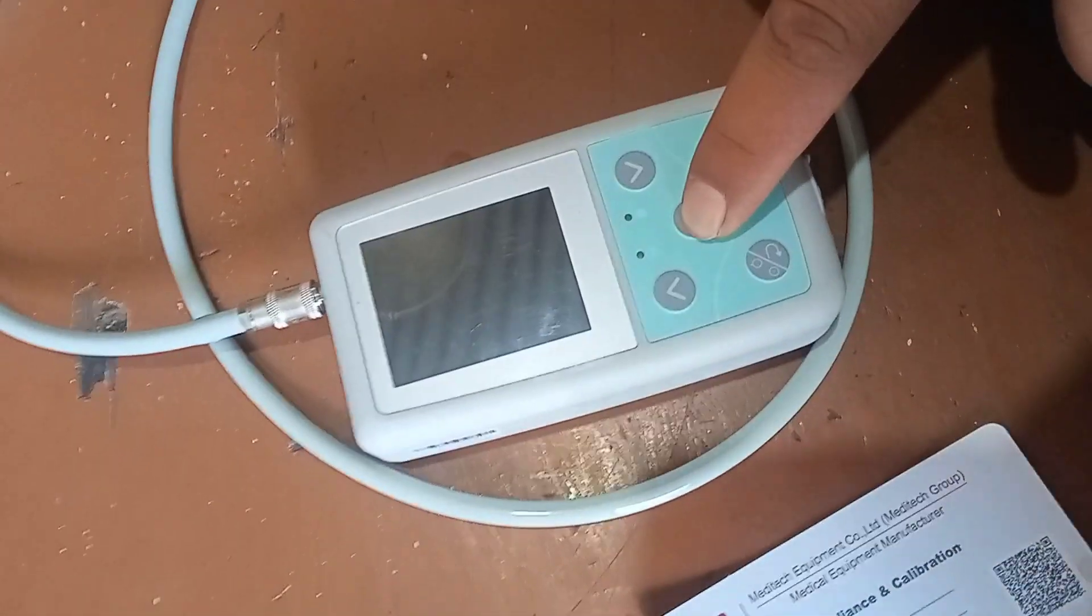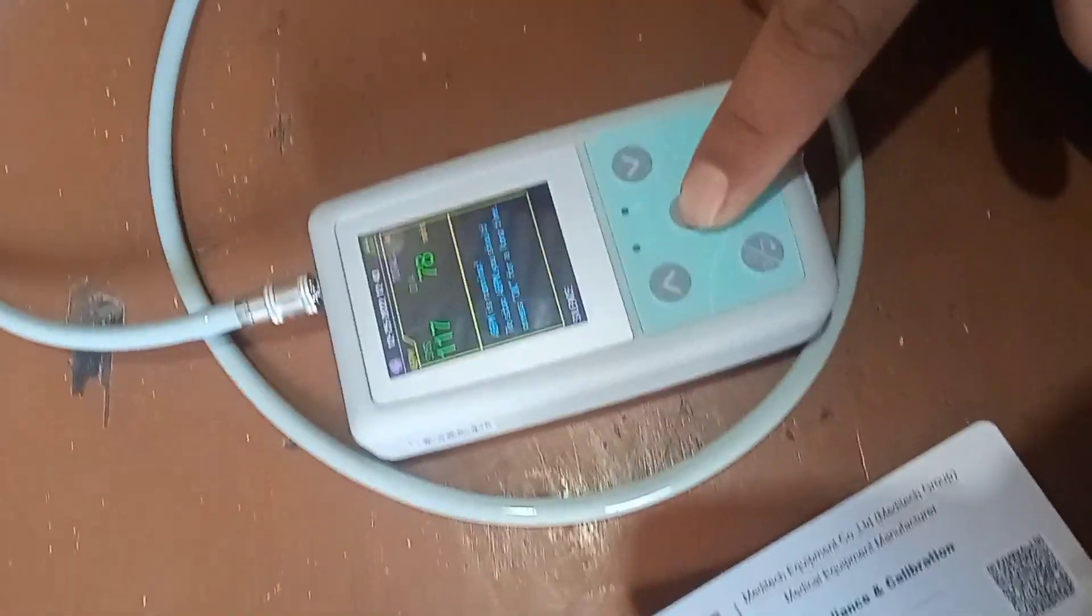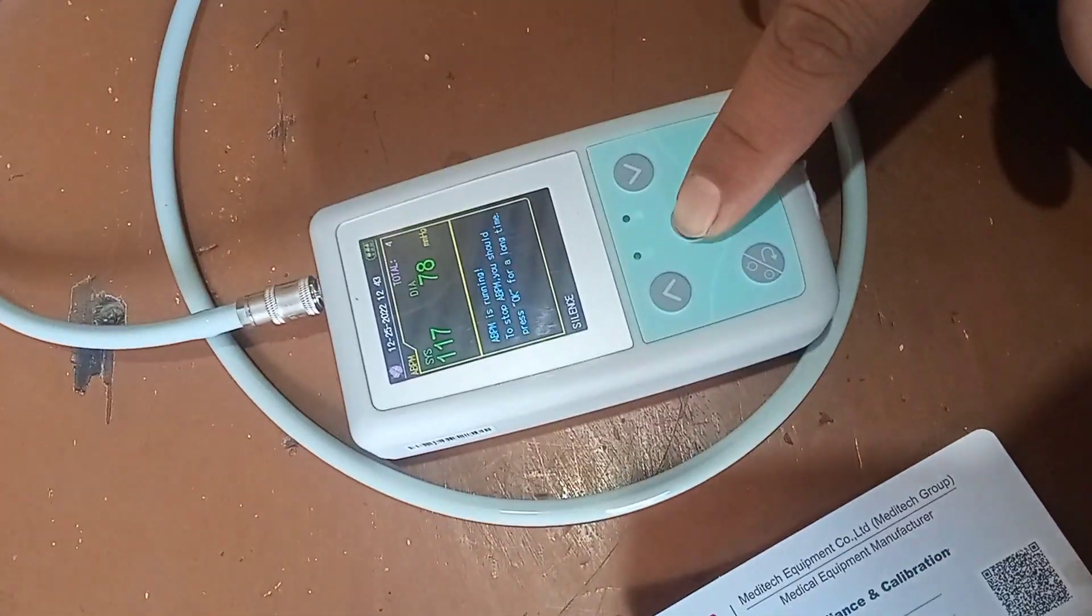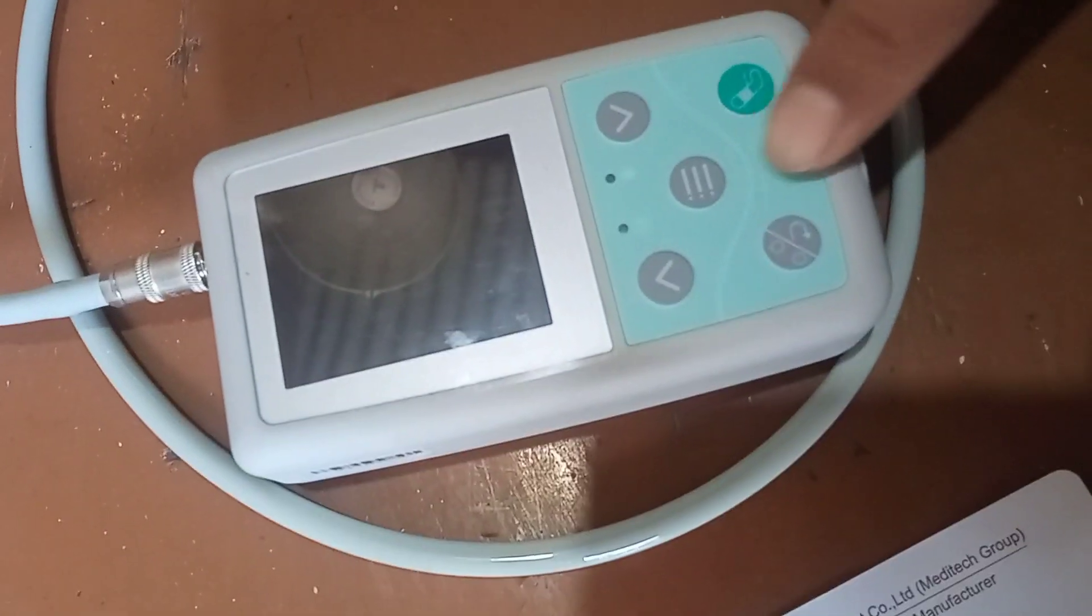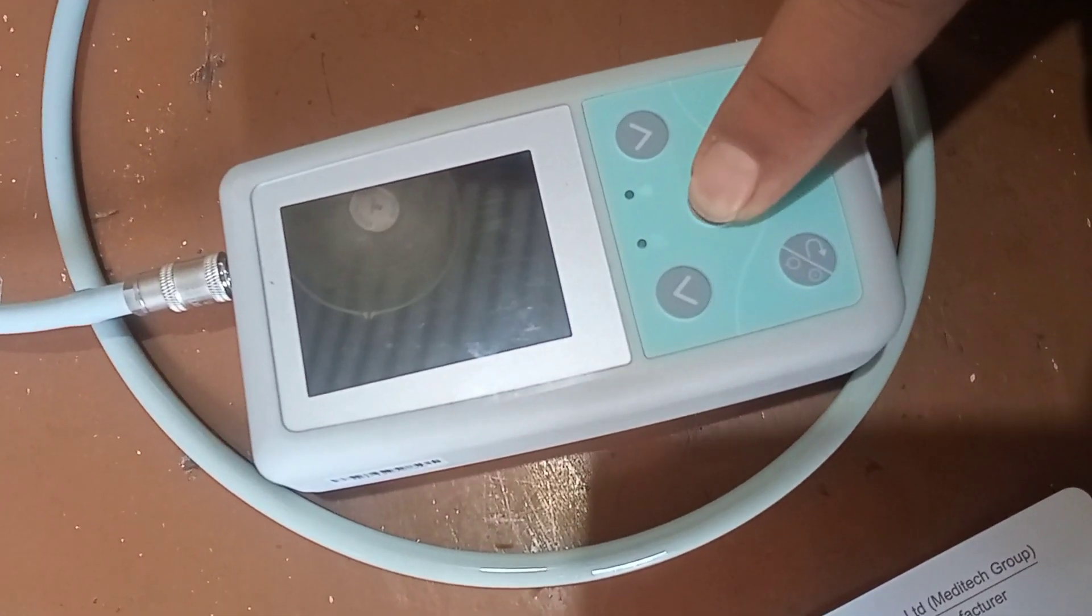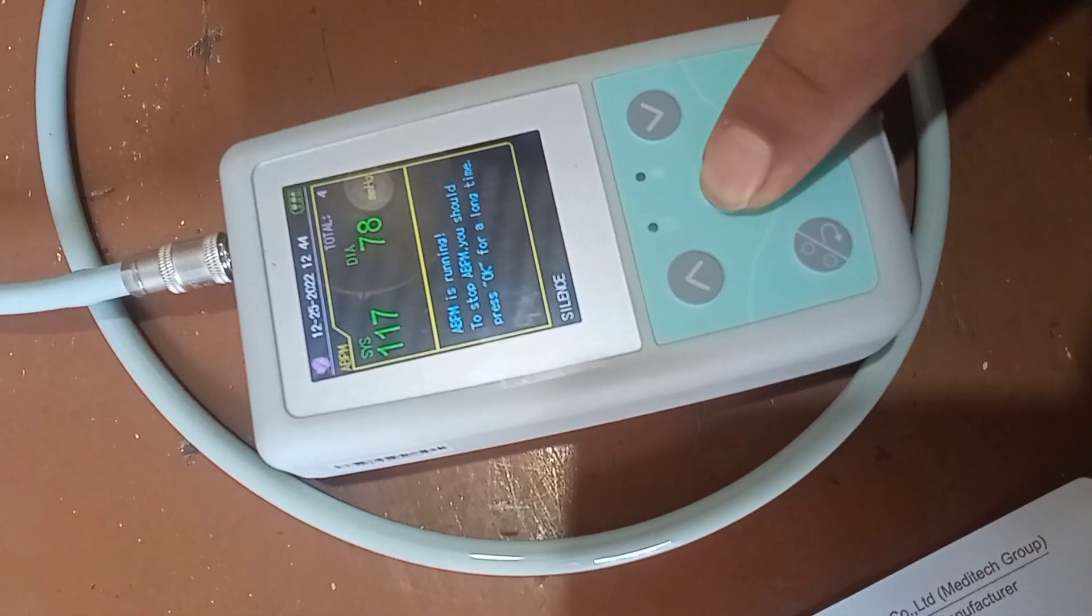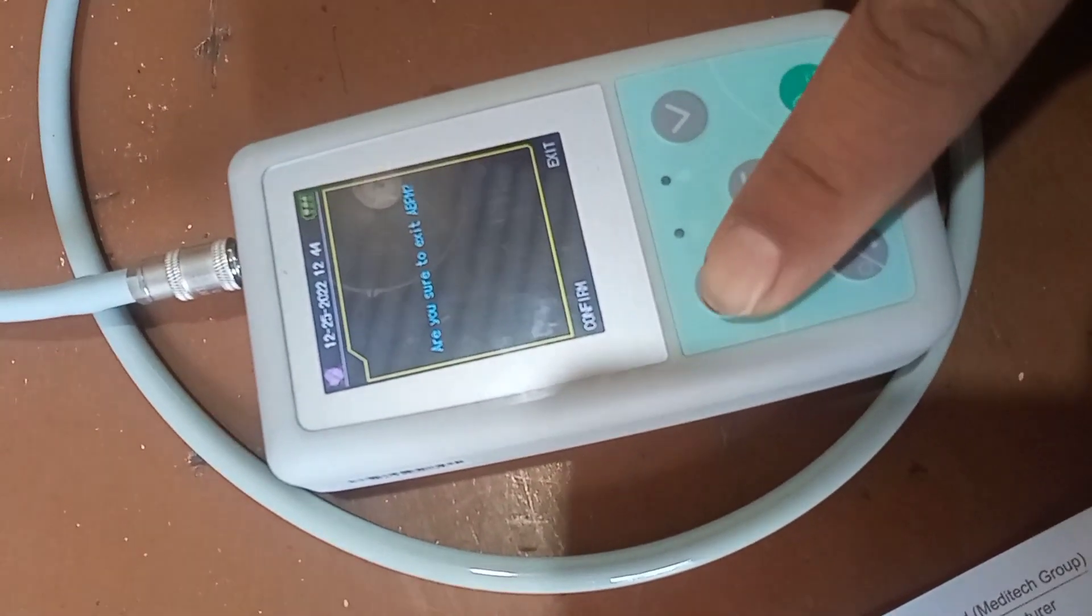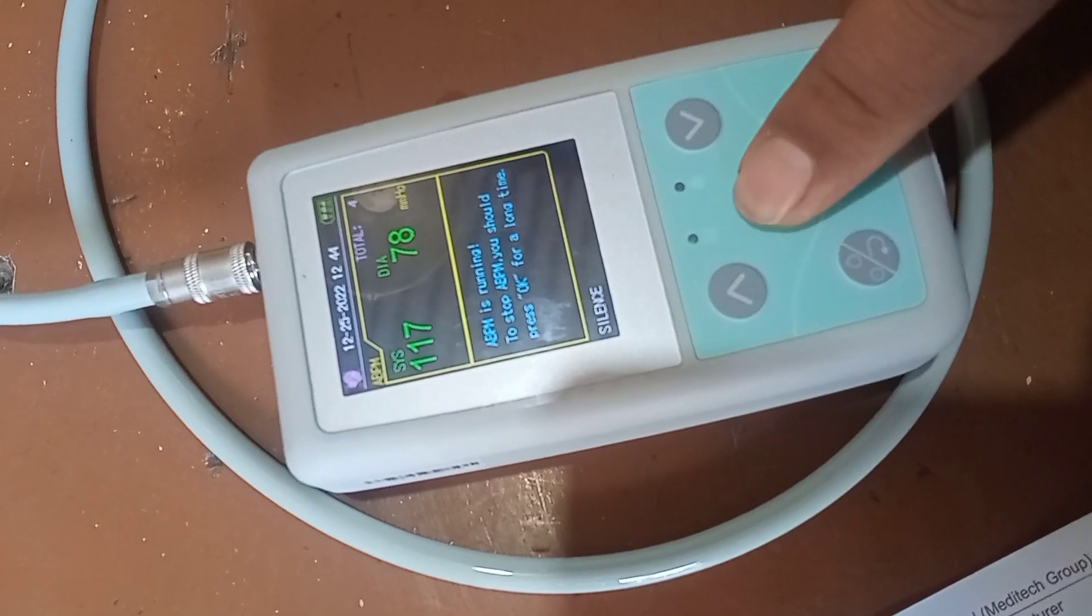After 24 hours of taking data from the patient, now we are going to stop the system to take the data. For that, we have to continuously click the middle button, and if you want to share that, OK, confirm.